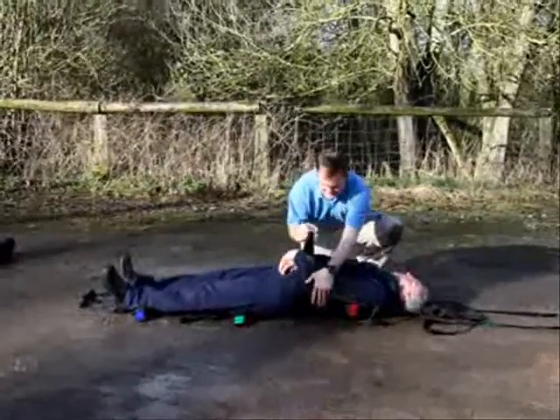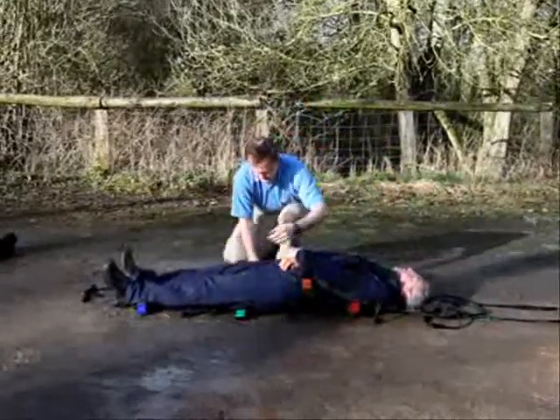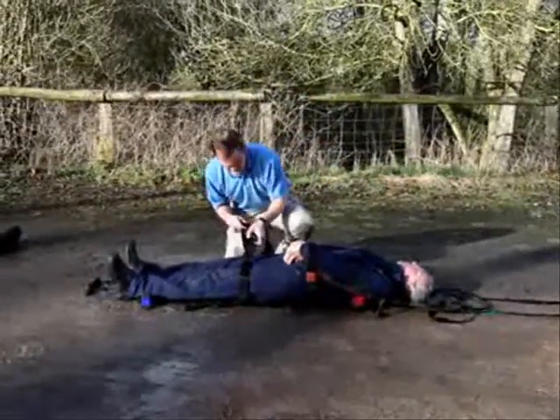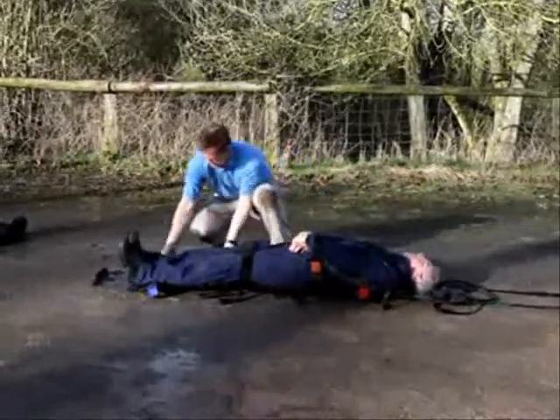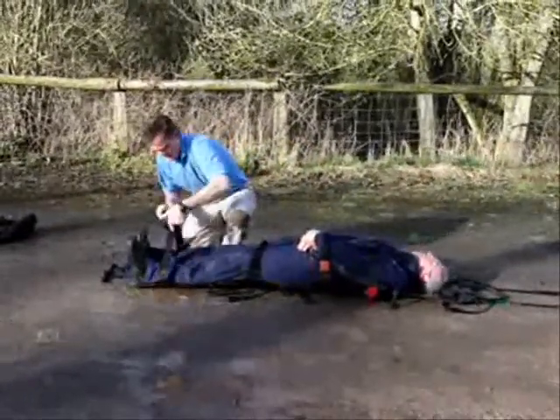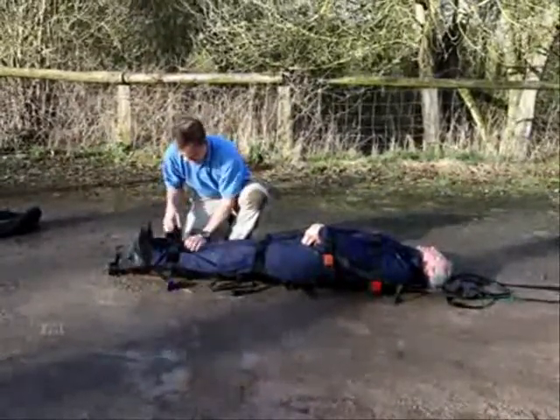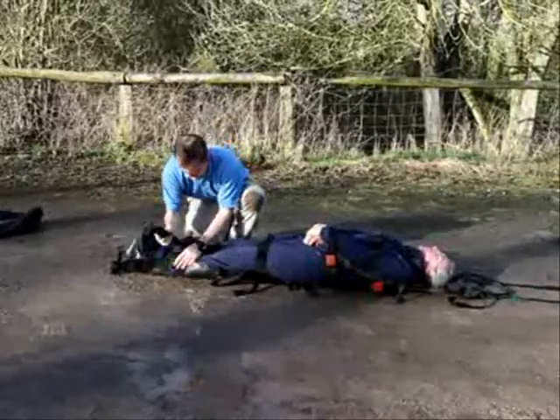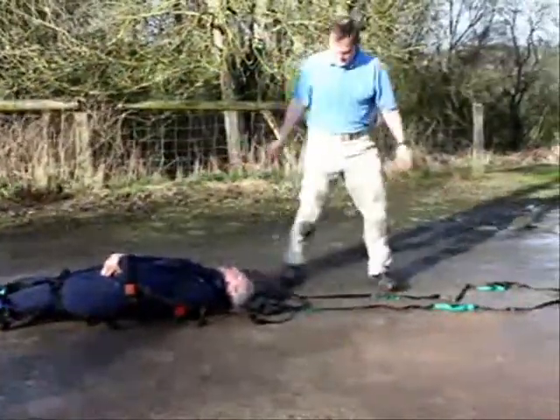The next one we tend to place across the casualty's wrists. Then one at the level of the thighs, and one down at the feet. The patient is now much more secure.